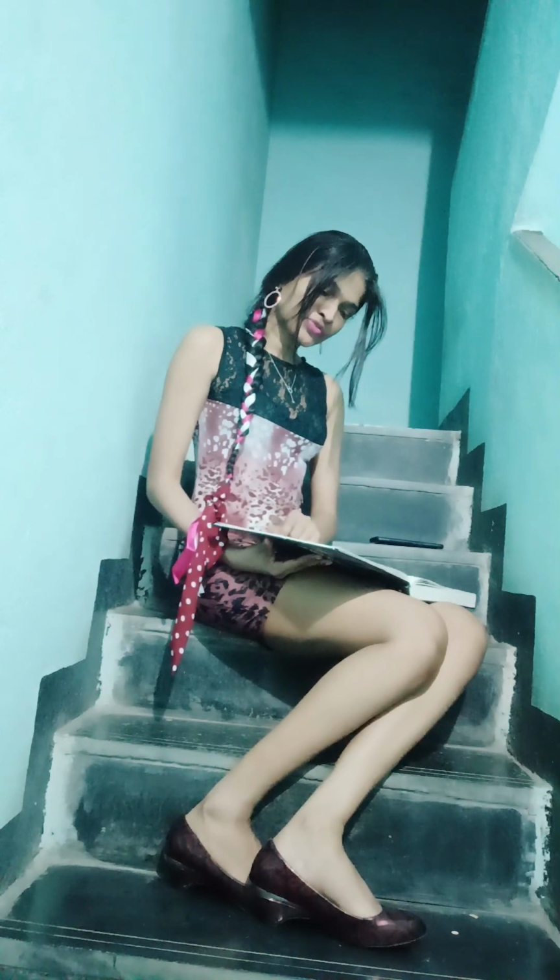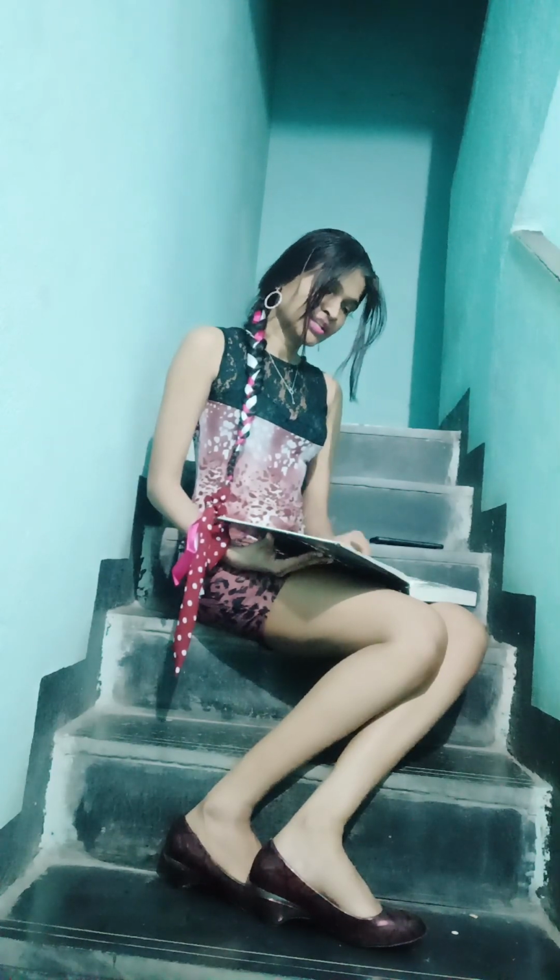This is particularly true with the Zeiss 4-mirror lenses and modified Goldmann type lenses because no viscous bridge is required. Gonio prisms with posterior radius of curvature closer to that of the anterior corneal surface may also reduce corneal distortion. Gonio prisms with taller mirrors facilitate visualization of narrow angles. Finally, because of its relatively small diameter of corneal contact, the Zeiss 4-mirror lens can also be used in compressive gonioscopy. So what are the comparisons of direct and indirect gonioscopy?